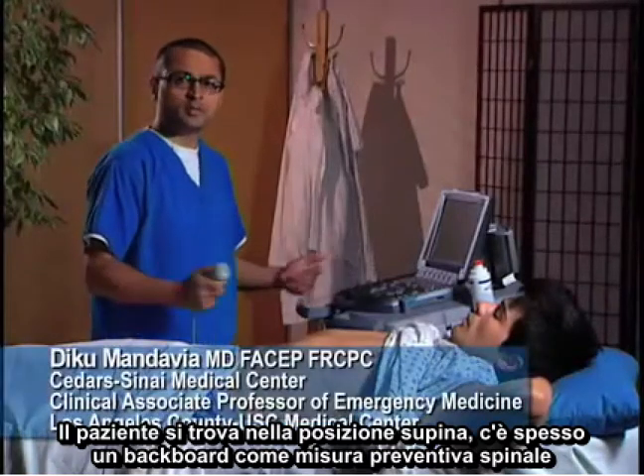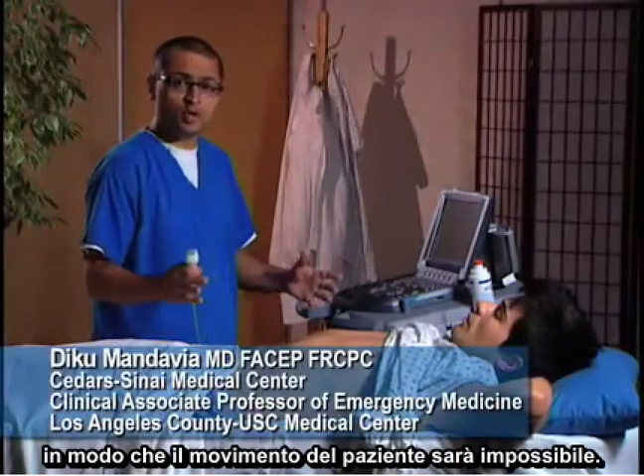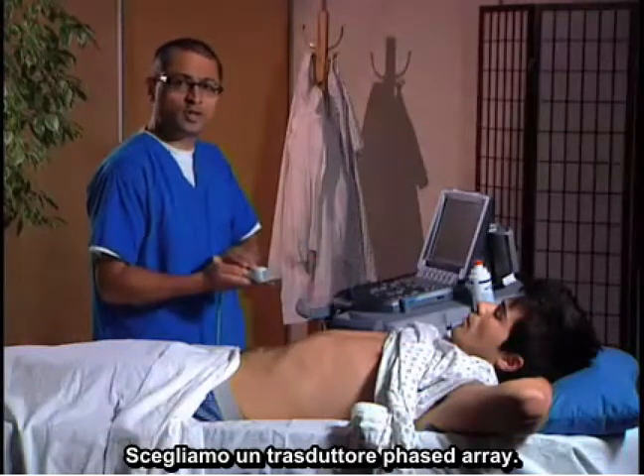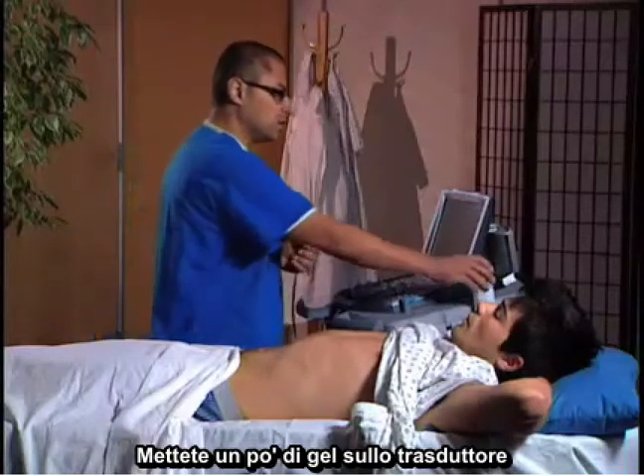The patient is going to arrive in a supine position — they'll often be on a backboard with full spinal precautions, so motion of the patient will be impossible. We're going to choose our transducer; we have chosen the phased array transducer, and we're going to put a little gel on top of it.